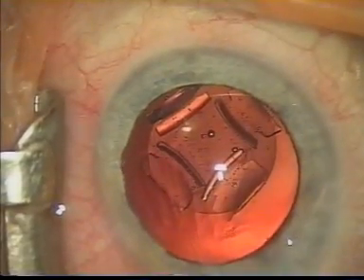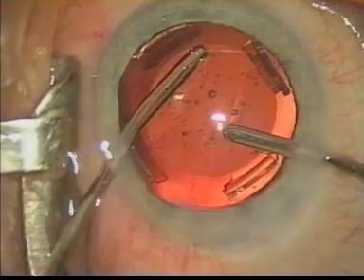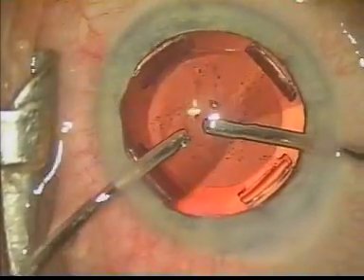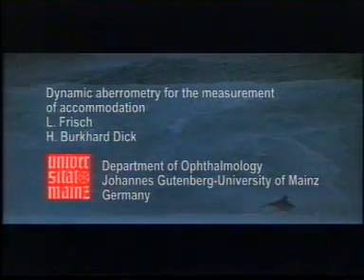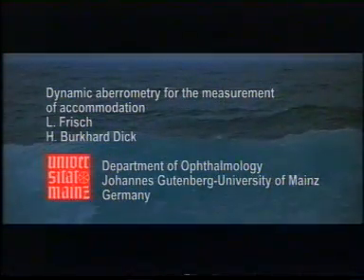In 24 of 27 eyes with different accommodative IOLs, an accommodative amplitude of different heights ranging from 0.5 to 2.75 diopters was detected. Obviously, additional factors like changes in aberrations contribute to the functionality of these various accommodative IOL designs. This dynamic wavefront evaluation method allows us to advance our knowledge in the field of accommodating IOLs towards the ultimate outcome, complete patient satisfaction.